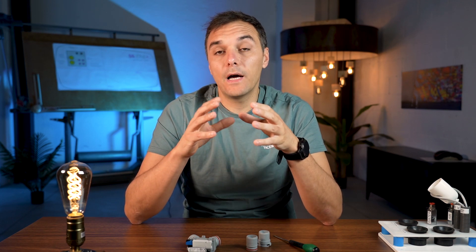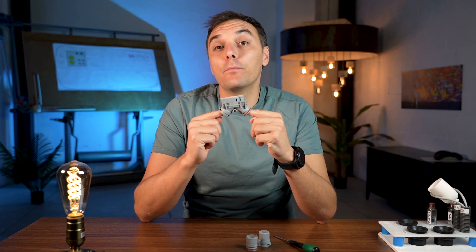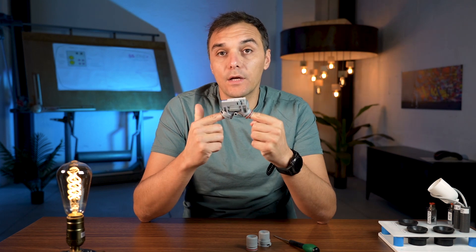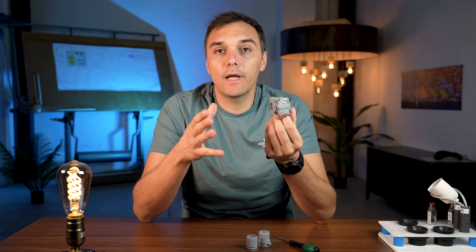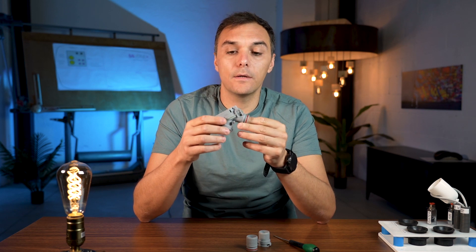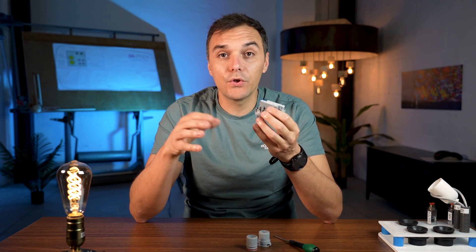We install the dual spittum valve when you need to combine all the suction together in one tube going to the suction motor, because you need to do amalgam separation. Keep in mind that this valve cannot be used with a venturi suction system — the air suction powered by a compressor with no suction motor. It must be used with a suction motor only, whether it's dry, wet, or liquid suction.